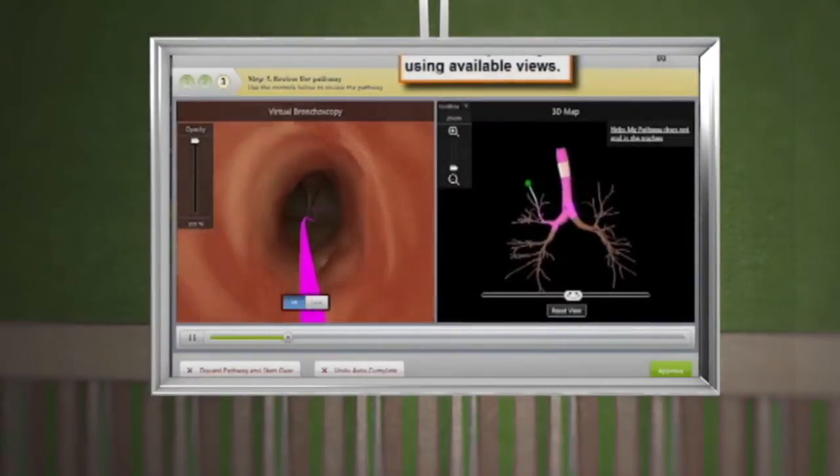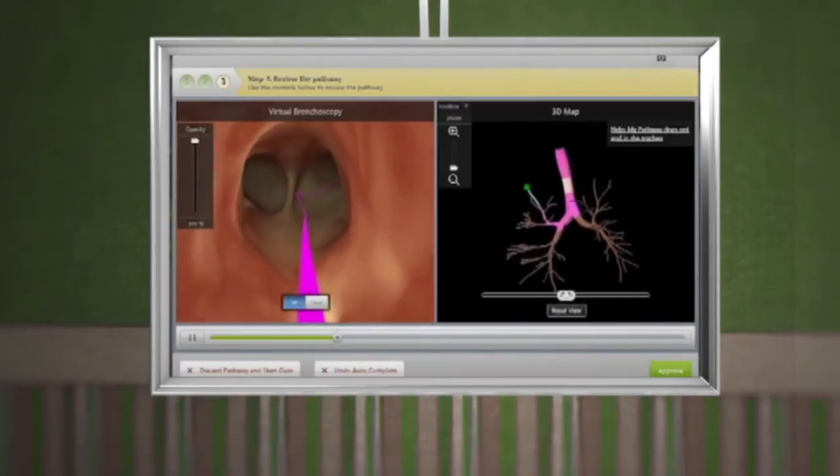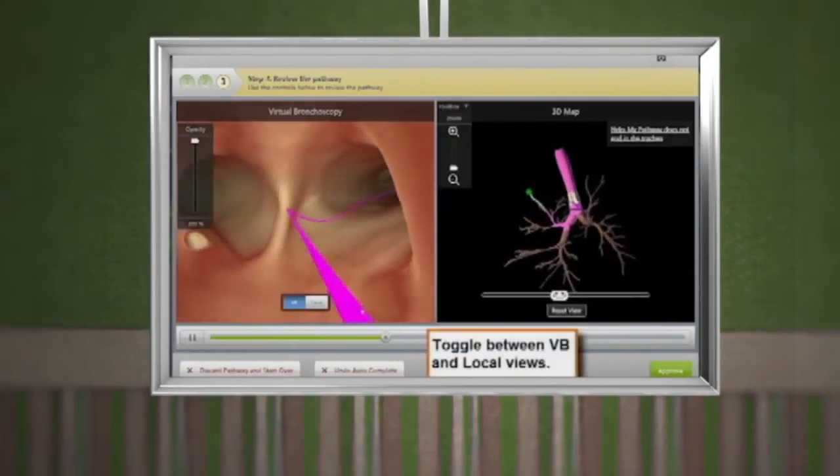Generally, the patient is under general anesthesia with a breathing tube in place. This ensures that the patient is going to be still and is not going to have any pain from anything that's done during the procedure. A bronchoscope is then advanced through the breathing tube down into the windpipe and into the airways of the lung.